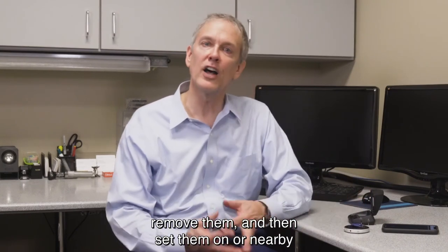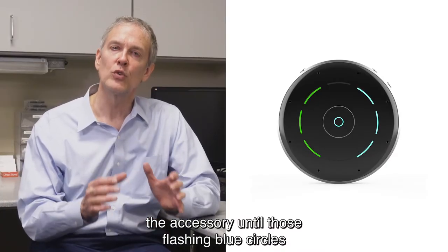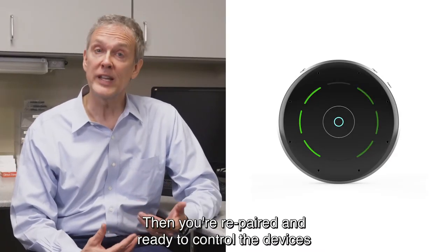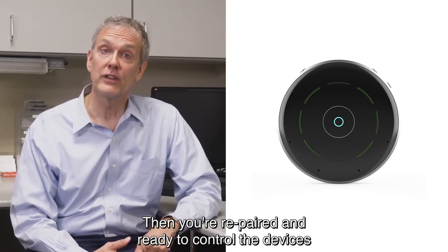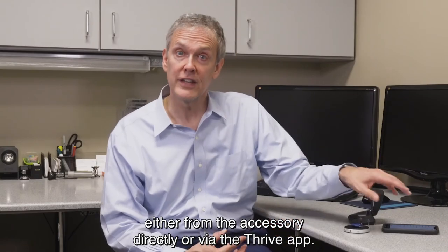Remove the hearing instruments from the case and set them on or nearby the accessory until those flashing blue circles turn to green. Then you're re-paired and ready to control the devices either from the accessory directly or via the Thrive app.